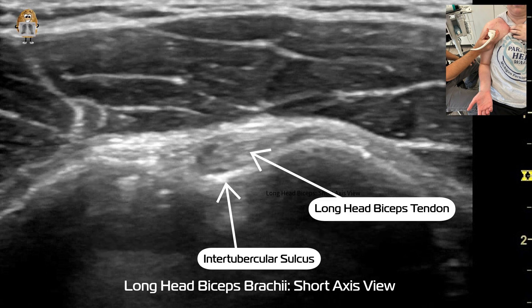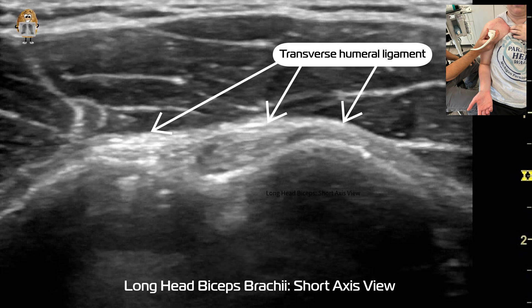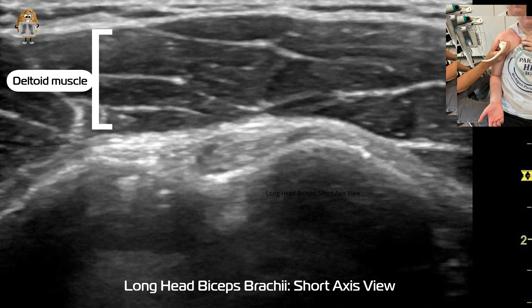Just superficial within that groove, you can see this oval-shaped structure, which would be the long head of the biceps tendon. We're looking for that consistent hyperechoic signaling with the tendon. You can also see the transverse humeral ligament, whose role is to stabilize the long head of the biceps within that sulcus. Superficial to those structures, you can see the more hypoechoic deltoid muscle with those connective tissue fibers within the muscle tissue.